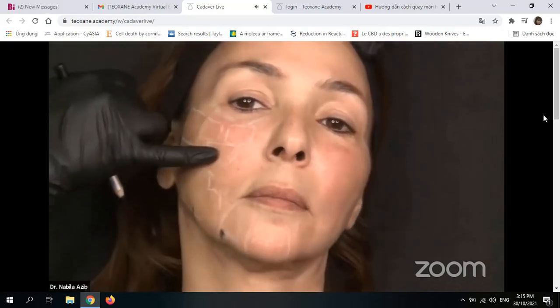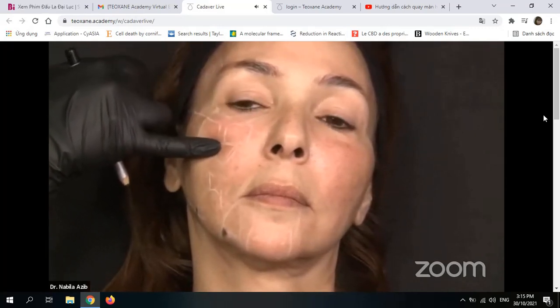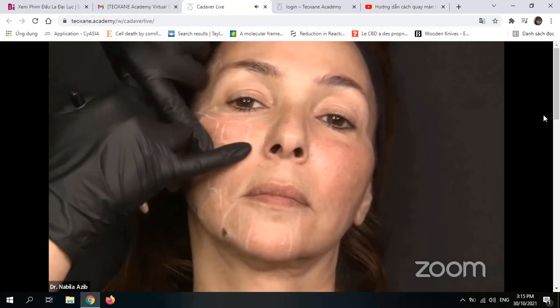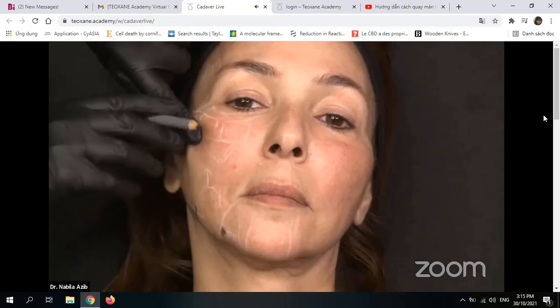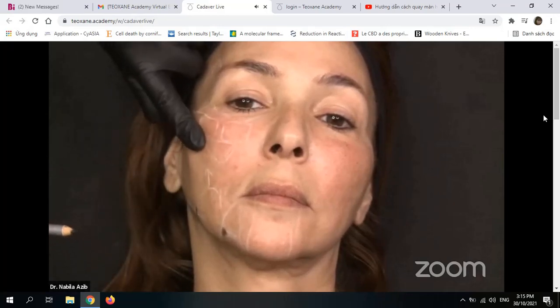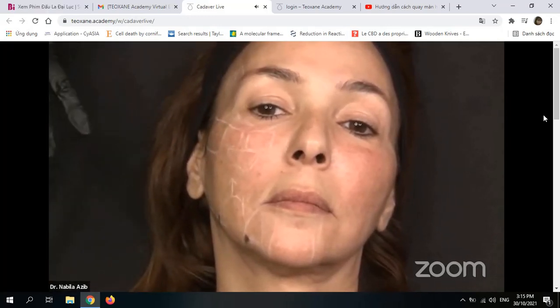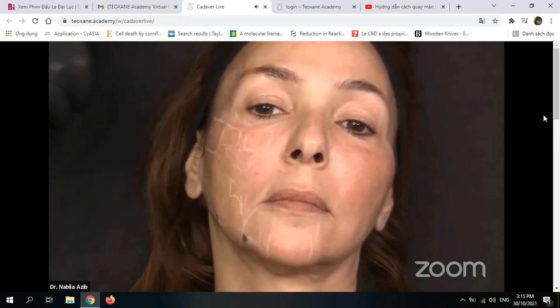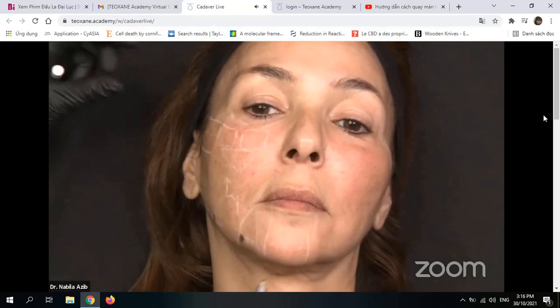But she has also a lax and thin skin, and then I want to have this lifting effect to pull the nasolabial, nasojugal fat compartment back here. It's like placing threads, injecting threads of RHA4 to lift back this nasolabial compartment. So I just follow the anatomy and the effects of the aging process and try to restore with the dynamic fillers that will give a natural look. Thank you. And one more question.